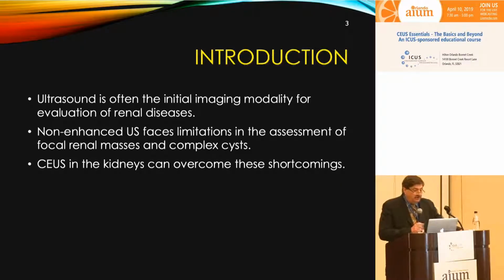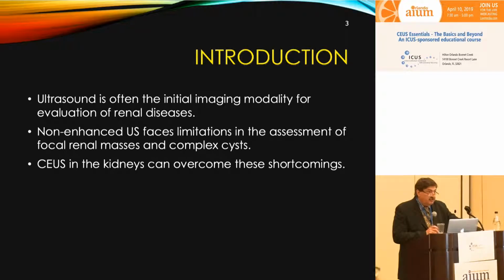Ultrasound is often the initial imaging modality for evaluation of renal disease, and non-enhanced ultrasound faces limitations in the assessment of focal renal masses and complex cysts. CEUS in the kidney can overcome these shortcomings.